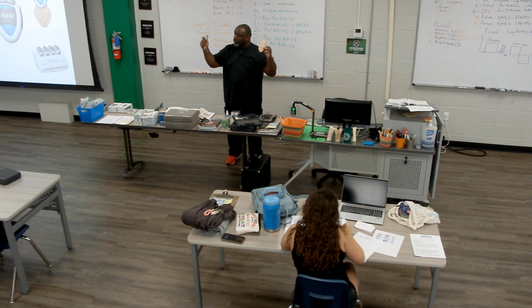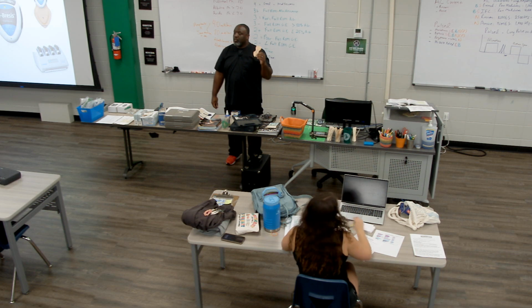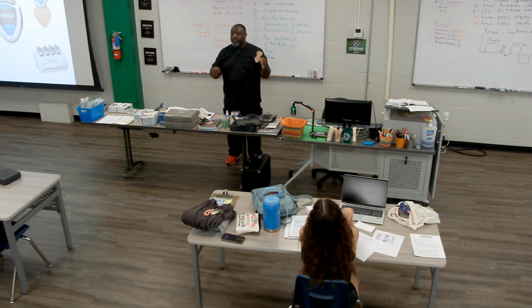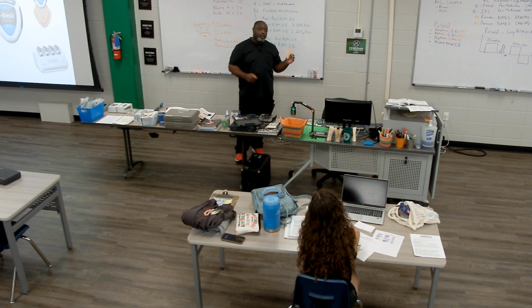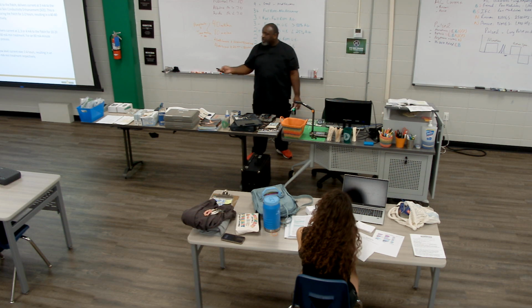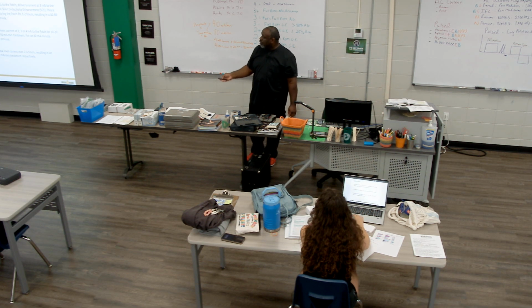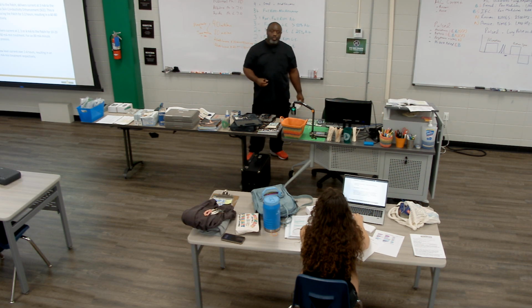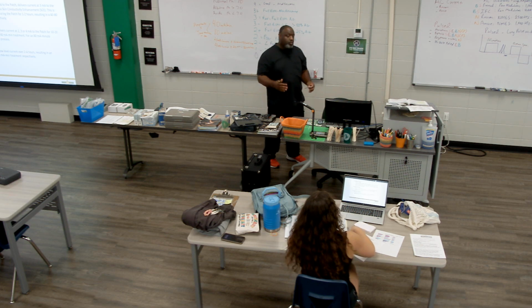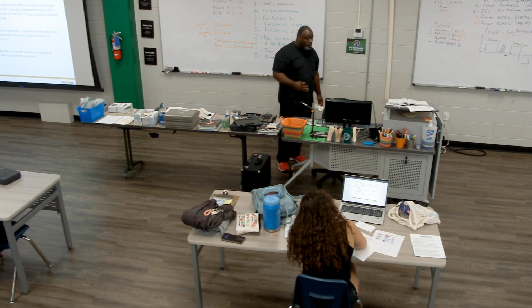The electrode is actually designed to be worn without the controller and still transcutaneously deliver medication to an area over a period of time. So it's called patch-only mode. In case your controller isn't working or something's going on with your controller, you can do patch-only mode, where you just put the drug or the medication on the electrode like you normally would, stick it on the patient, and tell them to wear it for 2 to 4 hours.